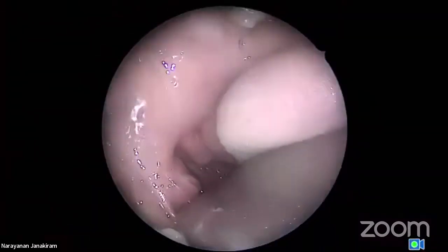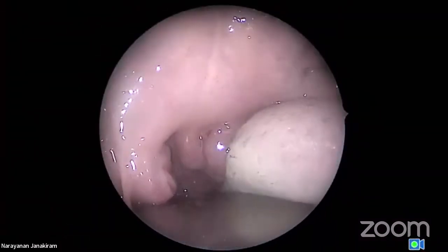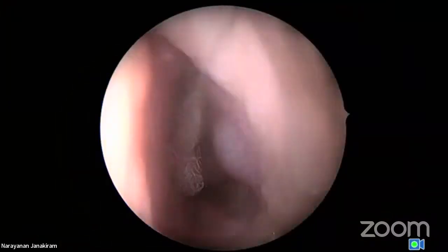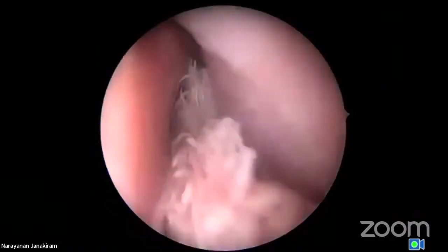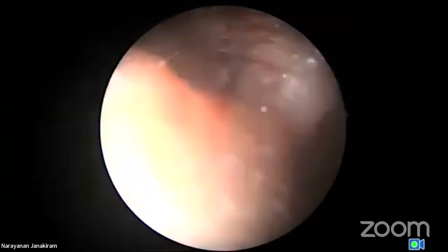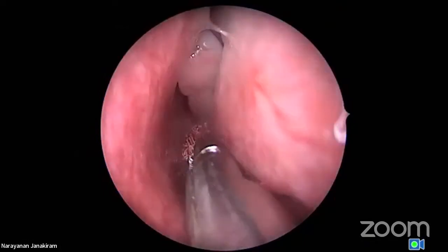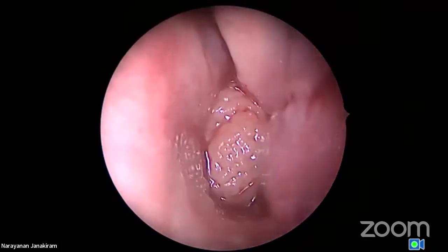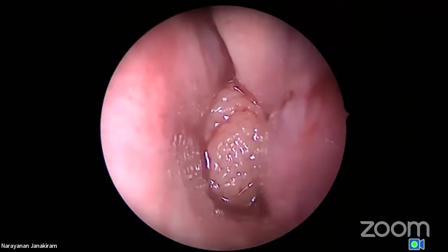Now you see here what I've done. You can see the huge tonsil as well. Can you see that clearly? And you can see now what I do, I keep it like that. And now I have to do it through the mouth, but let me see. If I can do through the nose, it's very easy. Because if you do it through the mouth, both your 70-degree endoscope and the debrider are all through the mouth. Oh, you see, it's completely blocked, my dear friend. It's completely blocked. Oh my God. This is crazy stuff.